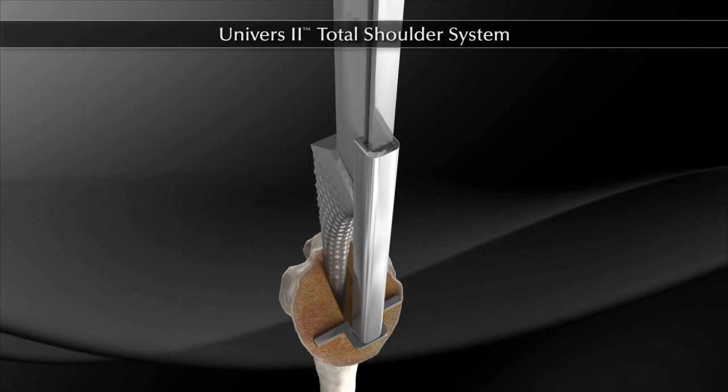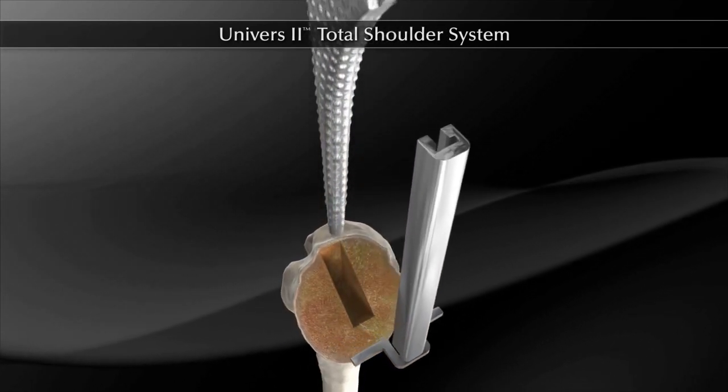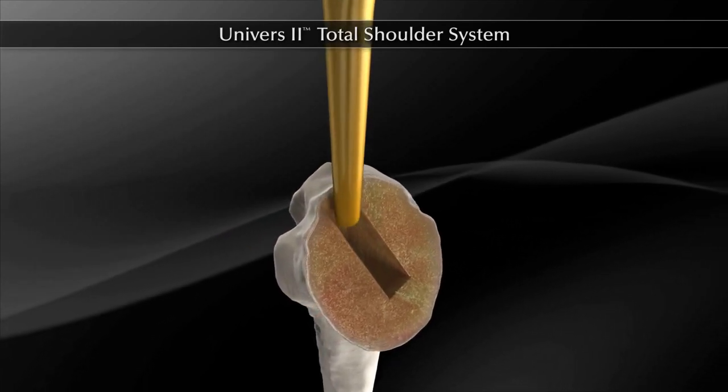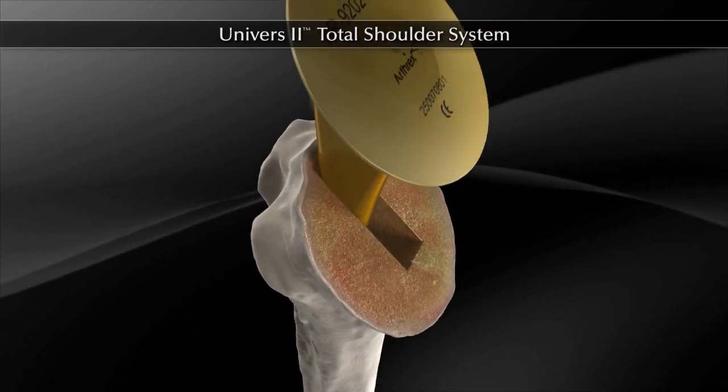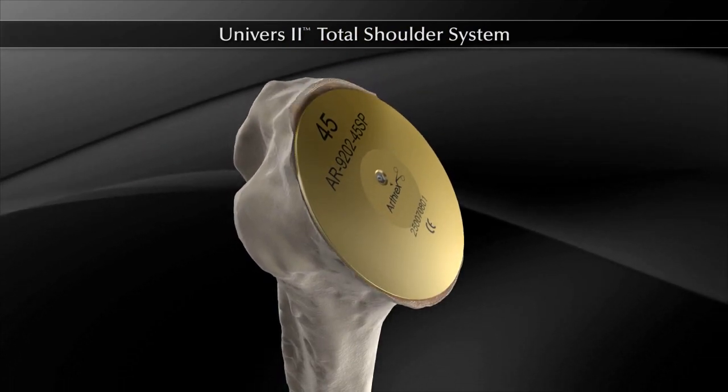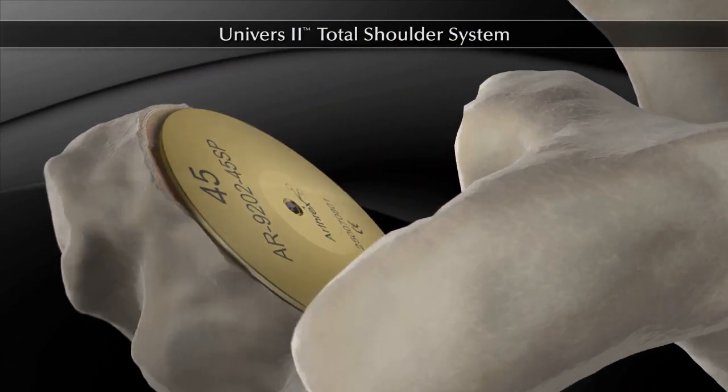A resection protector of appropriate diameter is assembled to a trial stem 1 size smaller than the canal preparation. The construct is inserted into the proximal humerus until the plate comes to rest on the humeral cut. Attention is then directed to glenoid preparation.